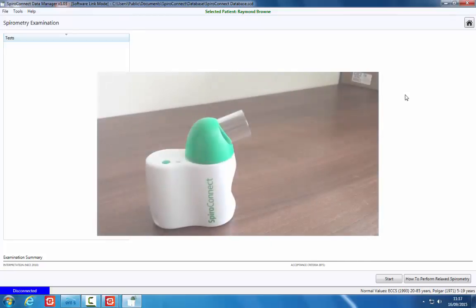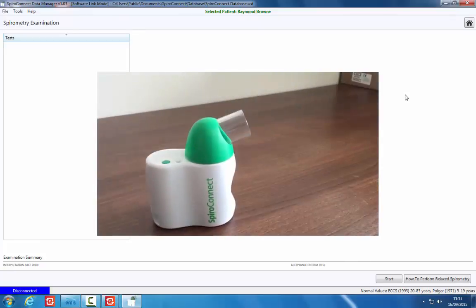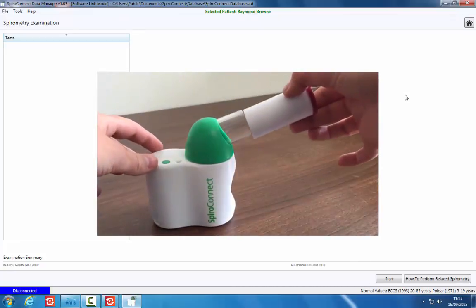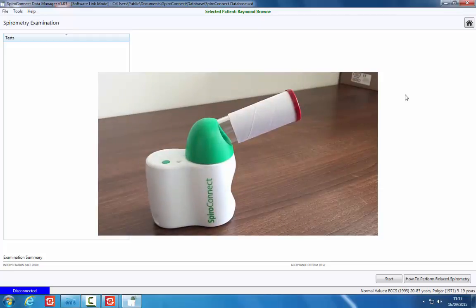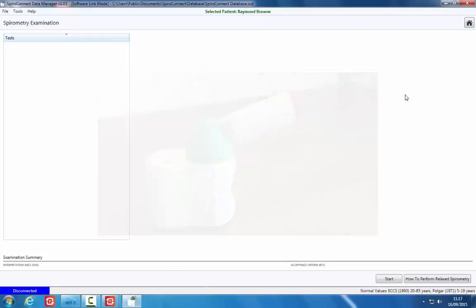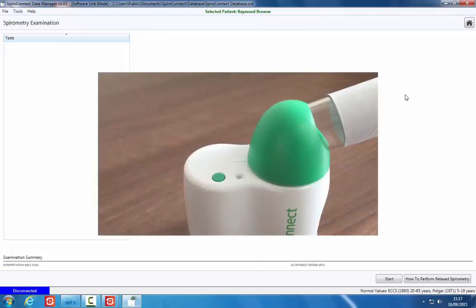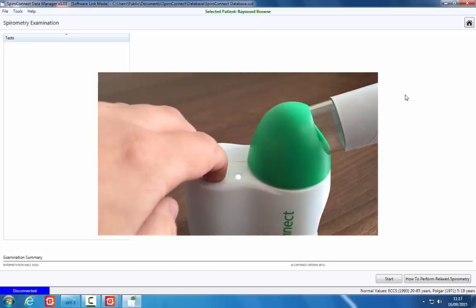Attach a cardboard mouthpiece to the spirometer. If performing only expiratory tests, we recommend using a one-way mouthpiece. Power on the device by pressing the green power button. Details on fitting or replacing the batteries can be found in a separate video.